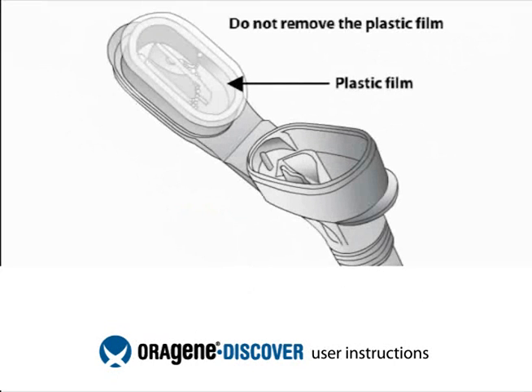The flip-top funnel lid contains a clear solution that will be mixed with the saliva sample when the kit is closed. Do not remove the plastic film.